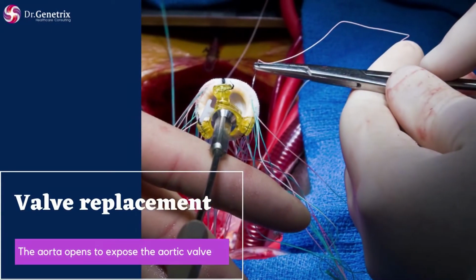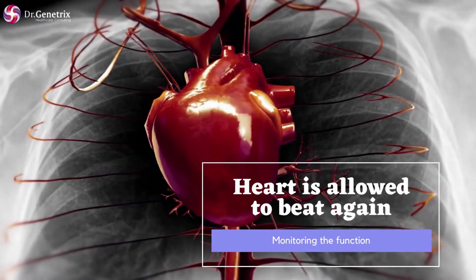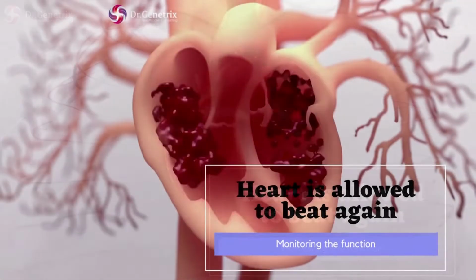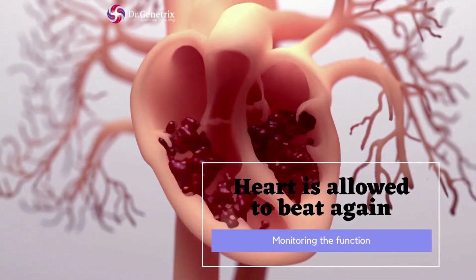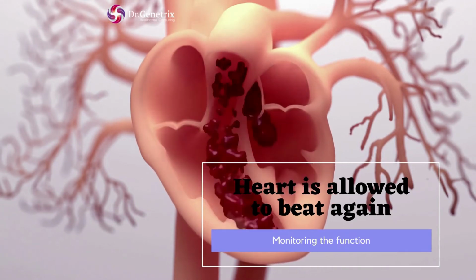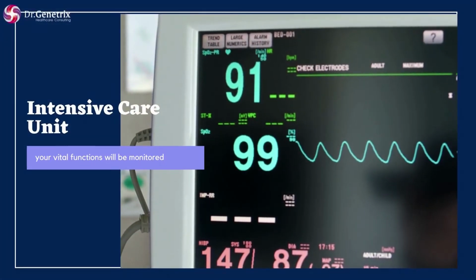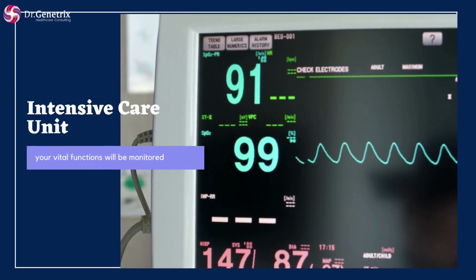Later, the heart will be allowed to pump again and let the blood flow naturally in order to check the new valve's function. Then you'll be detached from the machine. Placing a pacemaker is a likely procedure for a while to ensure the heart maintains a normal rhythm. After surgery, you'll be taken to the cardiac intensive care unit where your vital functions will be monitored.